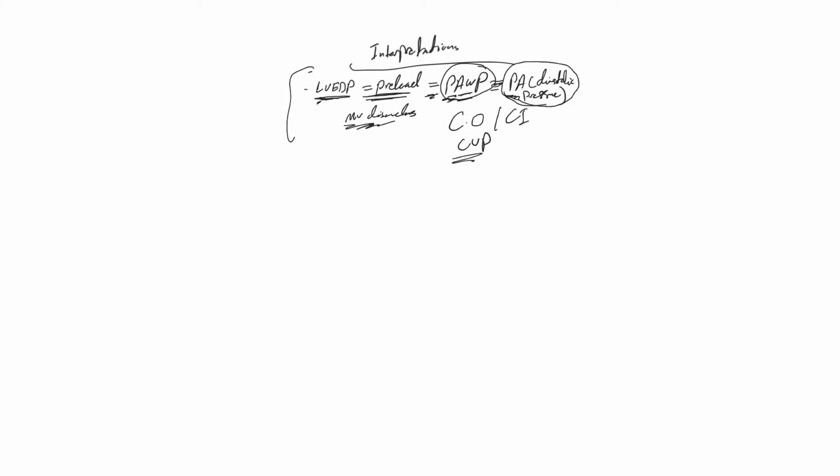Having this information, plus you have to know what the patient's problem is: history, physical exam, echo findings, chest x-ray findings, and I&O findings, because that tells you the volume status, in terms of how much volume the patient received and how much output in the urine. Is the patient 10 liters positive or 2 liters negative? That also makes a difference.